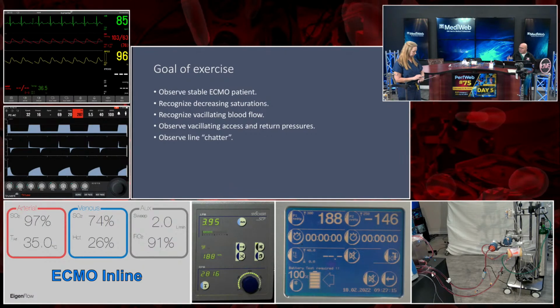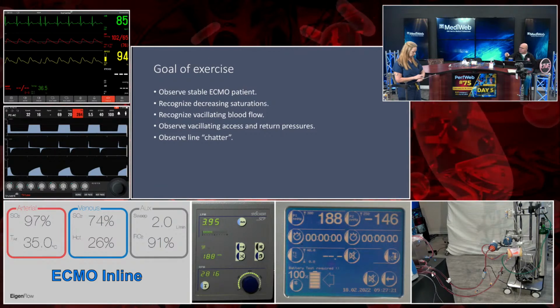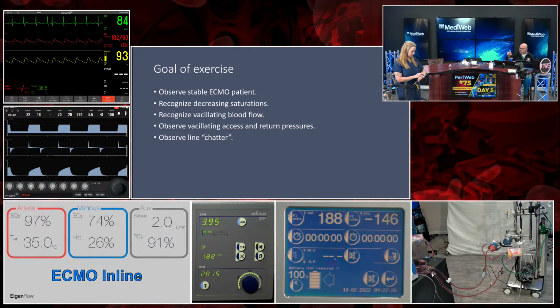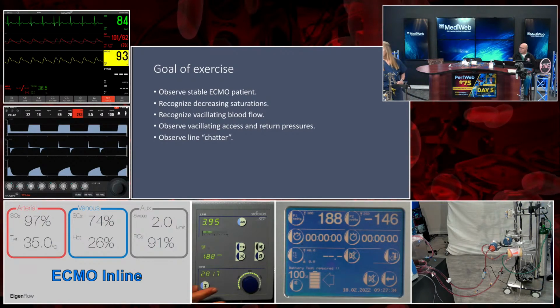Okay, so if you wouldn't mind, we do have some cavitation issues, so could you take just a second and turn the ECMO flow off? Go ahead and get the air out of the cone, and then we'll go back, because I can hear it. Oh, you want me to de-air? Yeah, just turn the flow all the way off.